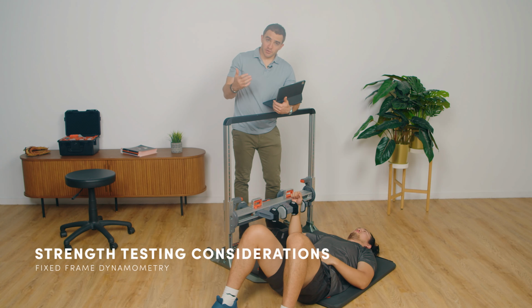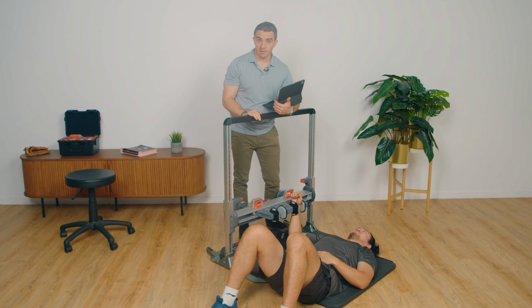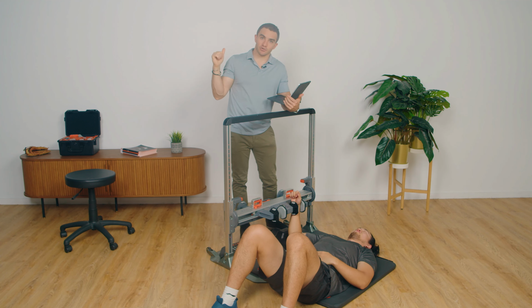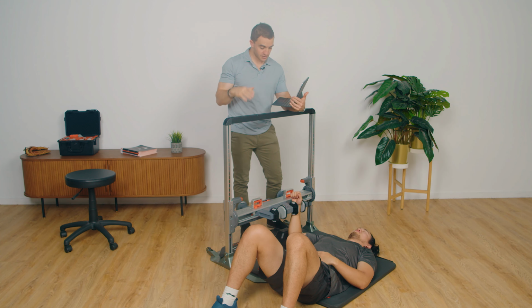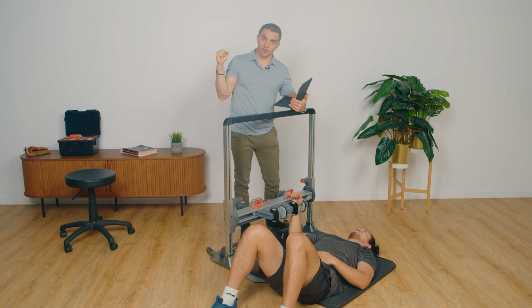As a patient progresses with their strength, and it's no longer easy or feasible to perform strength testing using a handheld dynamometer, simply because the patient gets too strong and it's hard to stabilize them using the technique that we showed earlier, we might progress to testing with a fixed frame dynamometer, in this case the force frame. So we'll test Cal's strength in internal and external rotation at 90 degrees of abduction. The same principles apply. This is a make test because Cal's pushing into the pad as hard as he can.